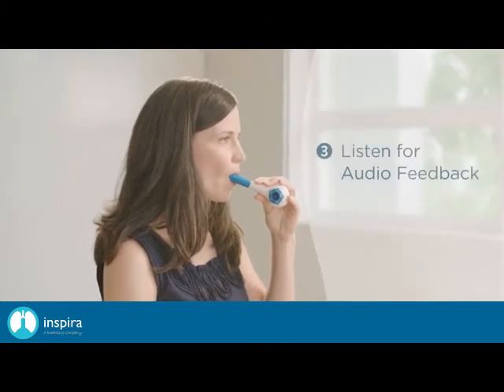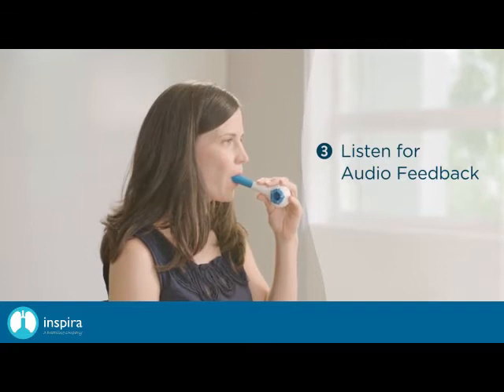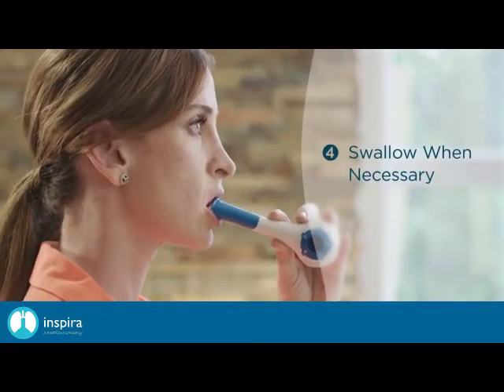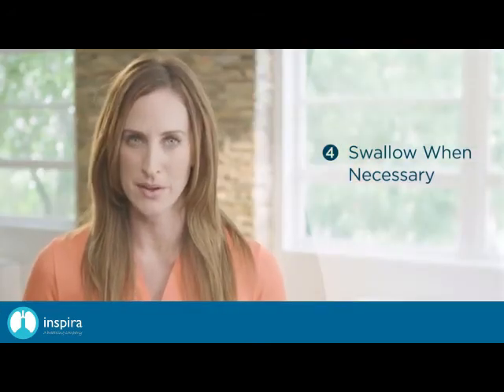Cue the patient to listen for strong wind sound for audio feedback, as a strong audible airflow should be heard for inhale and exhale. It's most helpful for the therapists to demonstrate with their own Breather. The patient should slightly remove the Breather from the mouth to swallow normally to prevent saliva buildup in the Breather.